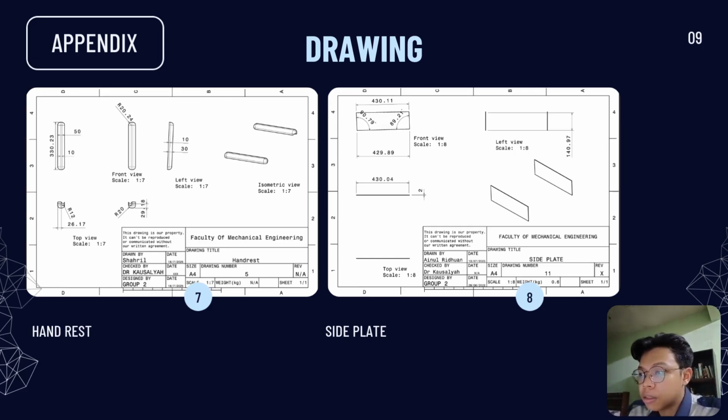And finally, the last part of the overview of our drawings, which is the handrest and also the side plate. This design is self-explanatory, simple. Basically, we make the side plate after we make the frame, since we could just trace back the frame in order to make the side plate. And the handrest is just a handrest. So self-explanatory, and this part is pretty simple.